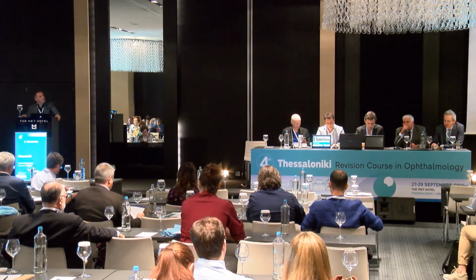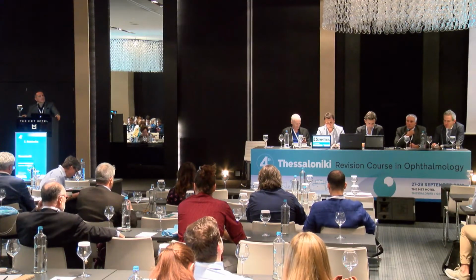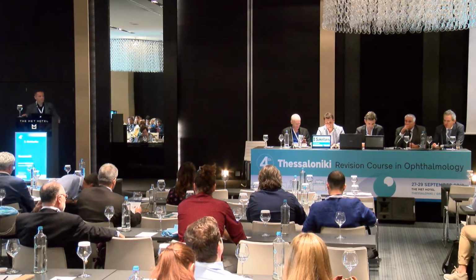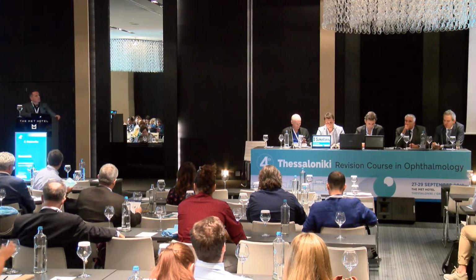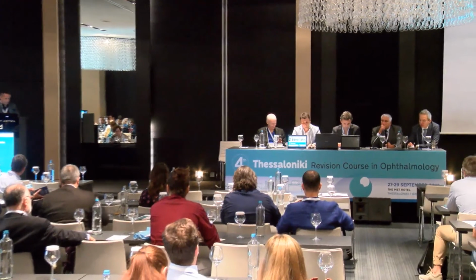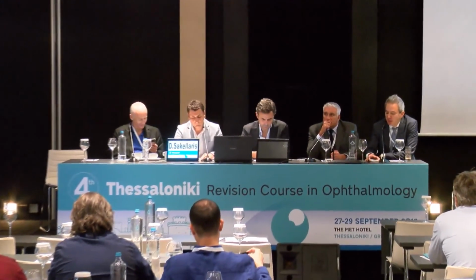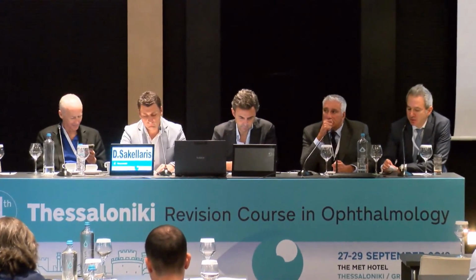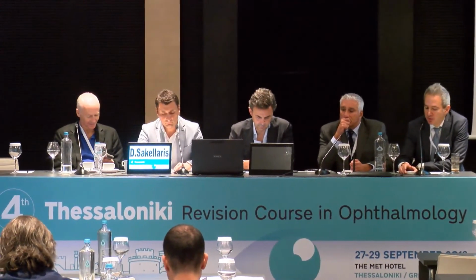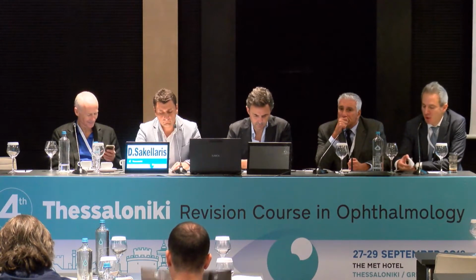Progression of the disease is not relevant, in my opinion, in cases of ring implantation combined with cross-linking. So if I have a patient who's a good candidate for ring implantation in terms of visual improvement, I will implant the rings and then perform the cross-linking procedure, because we have long-term results on that.